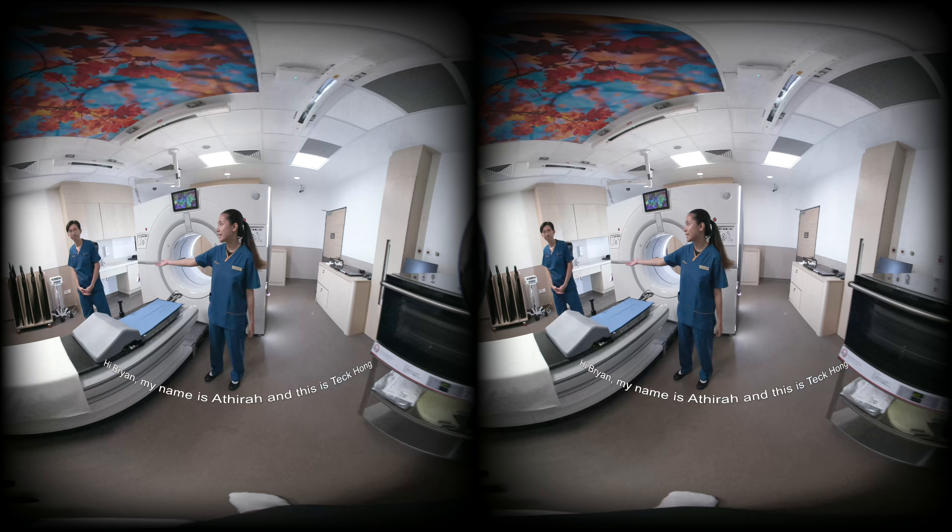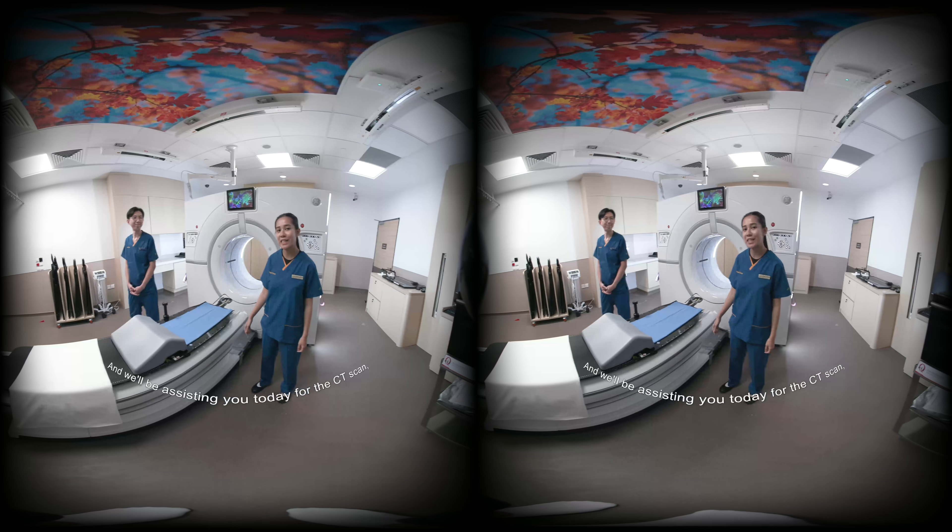Hi, Brian. My name is Atheera and this is Ted Kong. Hello. We'll be assisting you today for the CT scan.